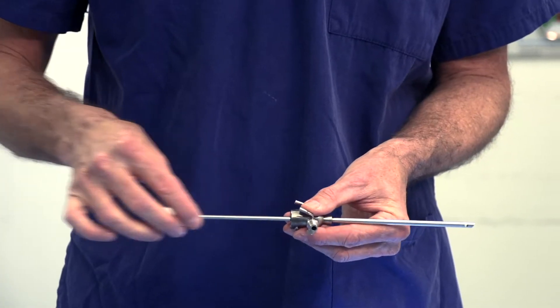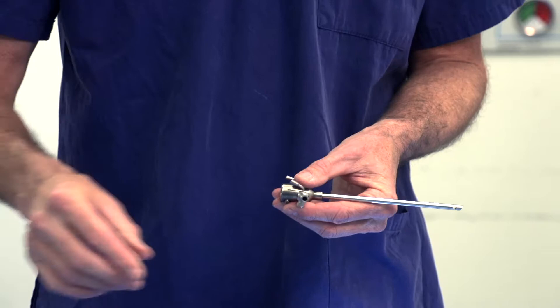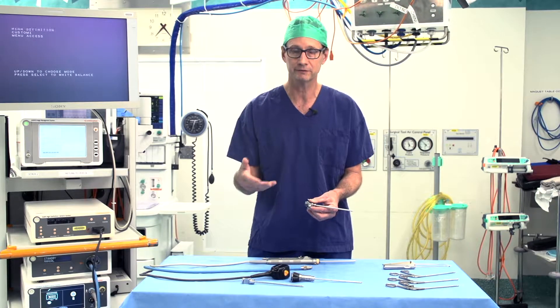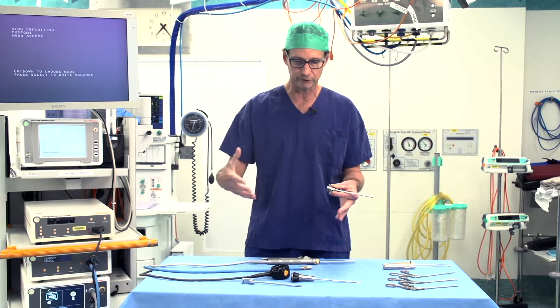We take the central piece out here. Water comes in here so that the arthroscopy is done underwater, if you like. We can see what we're doing and blow the joint up.